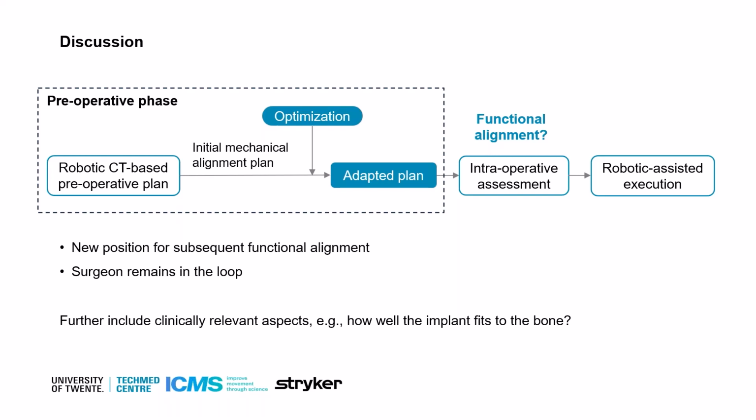To conclude, I should also emphasize that in this particular work, we only looked at the biomechanical aspects of the knee, including the strains and the kinematics, and it is important to further improve this way of thinking, including also aspects that could be relevant from a clinical standpoint. For example, how well the implant fits the bone after optimization, or what should be the clinically acceptable positional boundaries with respect to mechanical alignment, for example, to prevent impingement between the implant and the surrounding soft tissues.